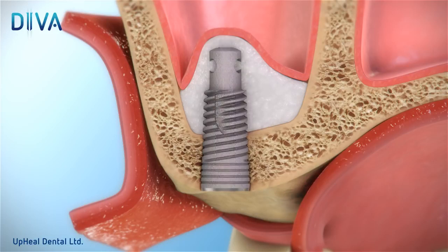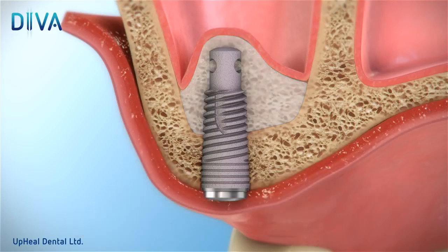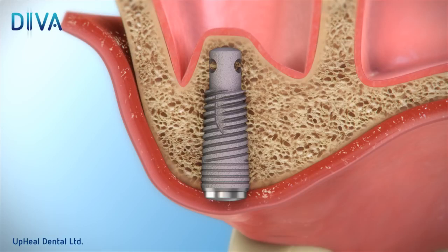Finally, cap the DIVA device with a cover screw. After a six to eight month osseointegration period, remove the cover screw to expose the implant and confirm that the inner valve screw is tight. Then cap the DIVA device with a healing screw. The implant is now ready for permanent prosthetic restoration.